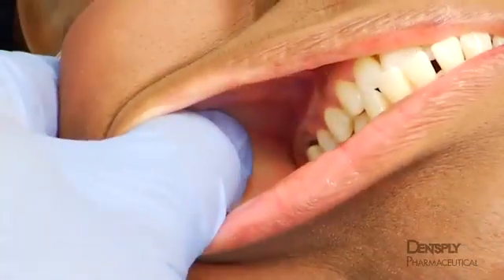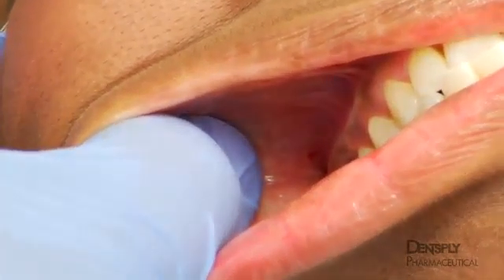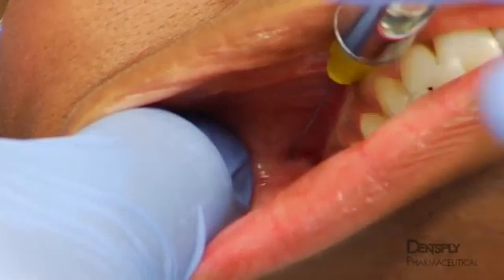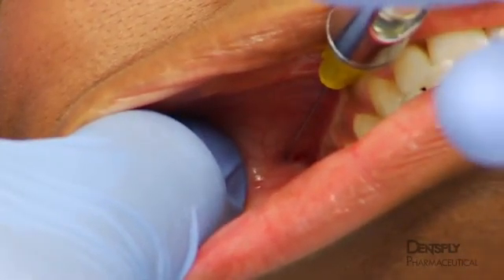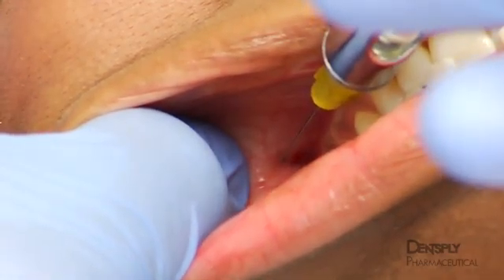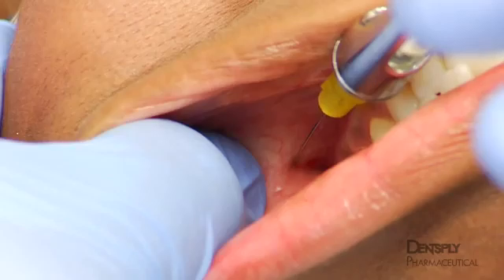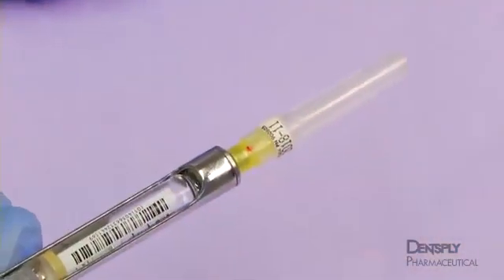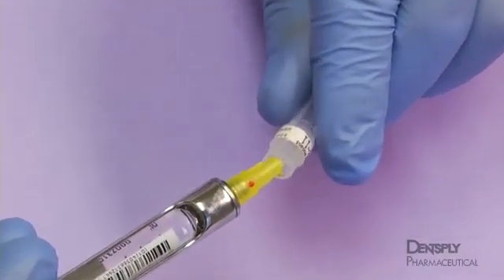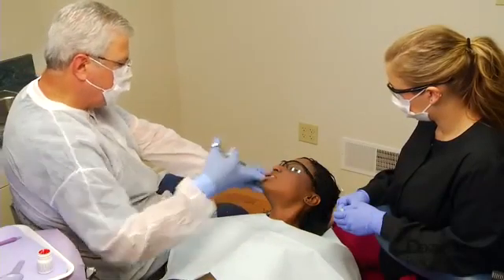When failure does occur, it is usually caused by the needle being angled too medially. The maxillary mucosa is sensitive to abrasion by the syringe as it is advanced posteriorly. In response, the patient may move to avoid the stimulation, or the clinician may adjust the syringe to improve patient comfort. In either case, lateral rotation of the syringe automatically forces the needle medially. A possible answer to this problem is to bend the needle approximately 15 degrees at the hub. Then the syringe can be kept off the mucosa as the needle is advanced posteriorly.